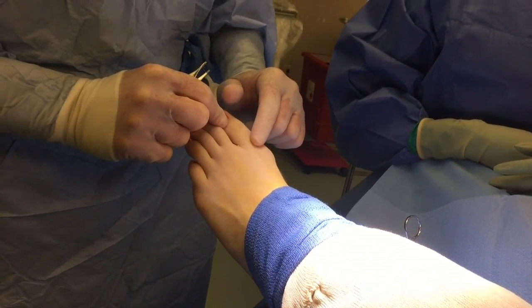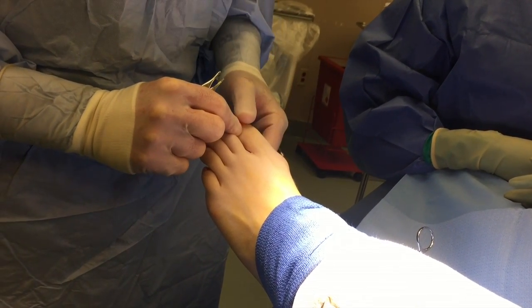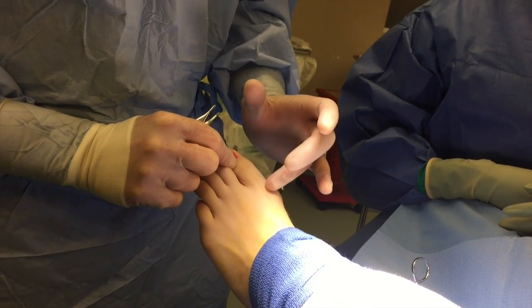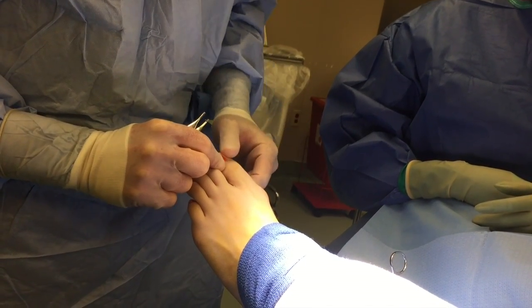We're going to fixate the fracture with bone pins — natural bone pins made out of cortical bone called TinFuse from Wright Medical Group — and they will fixate the fracture instead of using a metallic screw or staple.